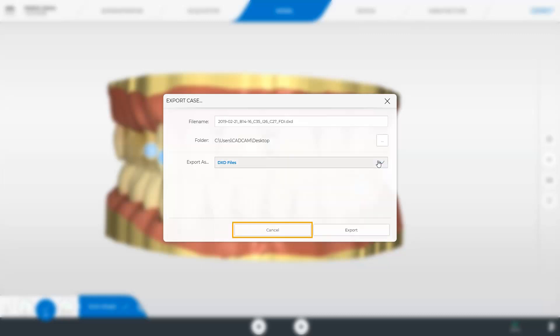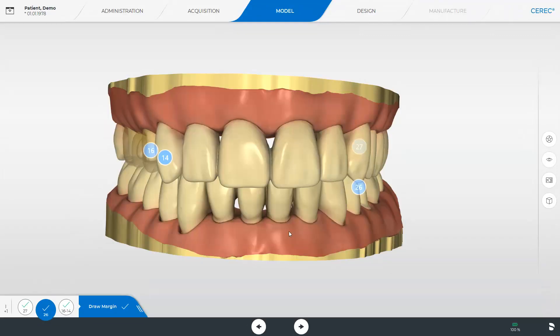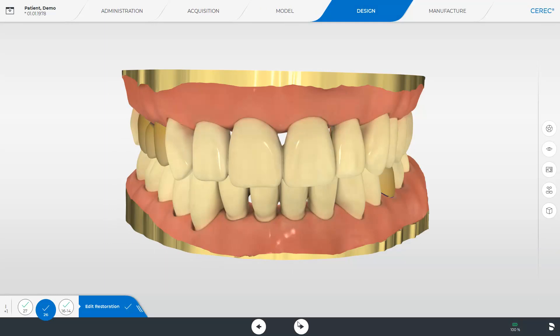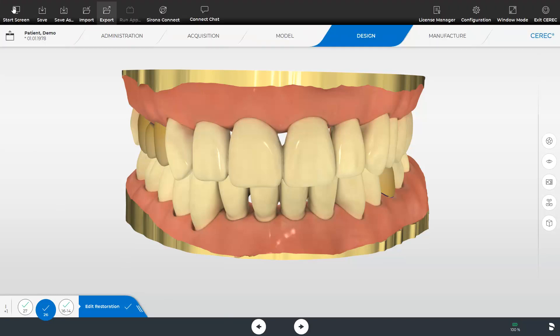We close the export options once again and switch to the next phase, the design phase. This phase is similar to the model phase before. We open our system menu and can transmit the model data to our partner lab via the ConnectCase Center portal. If the transmitted data are opened with the InLab or ExoCAD software, the marked preparation margin will also be displayed in addition to the model data.